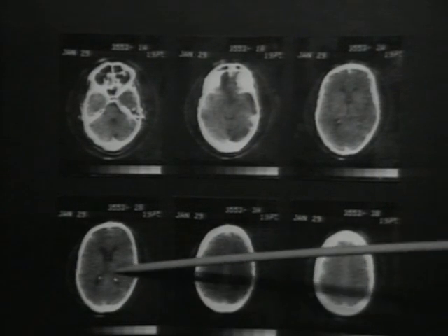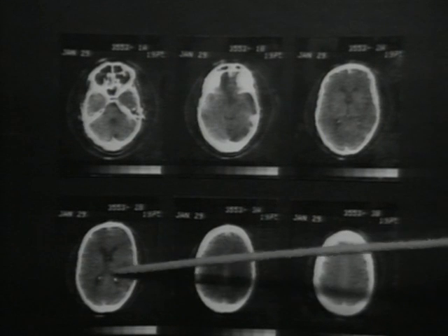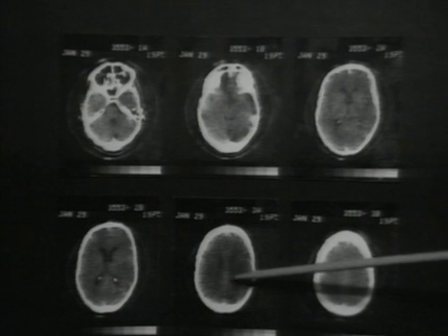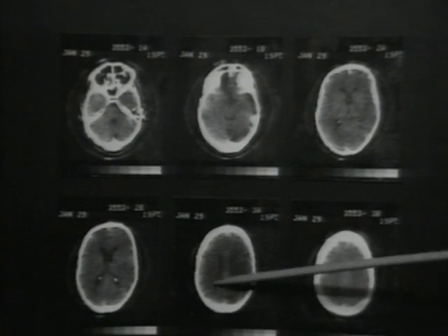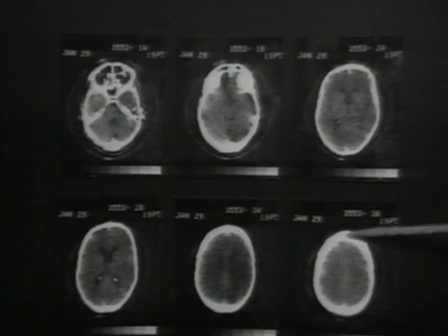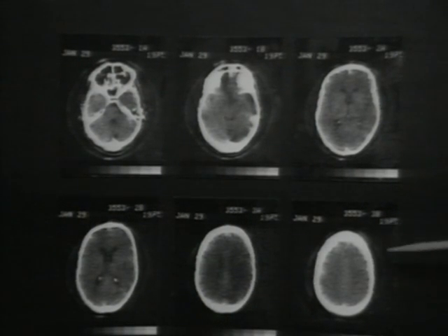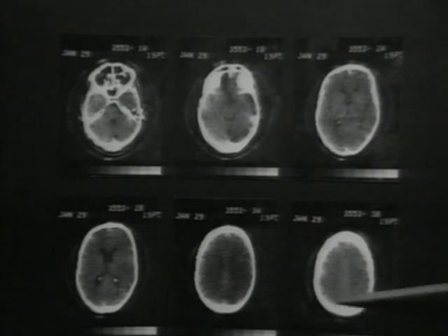Still coming up, we see the top halves of the lateral ventricles, again with the choroid plexuses and the third ventricle, and coming still higher, we see the extreme parts of the roof of the lateral ventricles with the corpus callosum between them. In the topmost cut, we've come up above the major structures, and we now see the homogeneous density of the white matter.